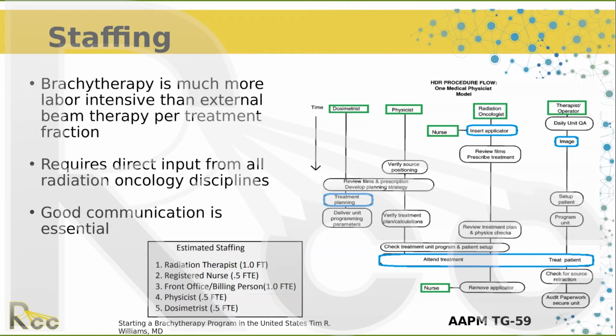And if you already have a program, you would still benefit from doing a failure modes and effects analysis, looking at the weak points in your chain, understanding your flow and documenting it, so that if someone else takes the role of the nurse or a new therapist comes, you have adequate documentation for onboarding.